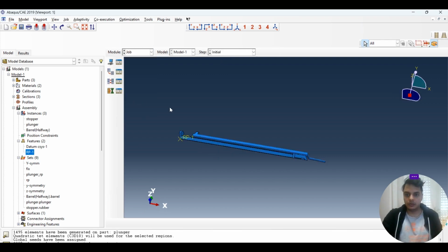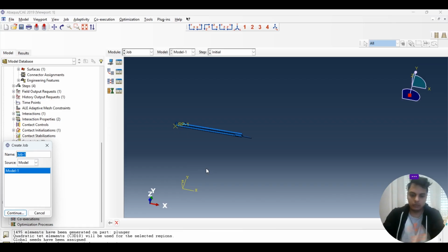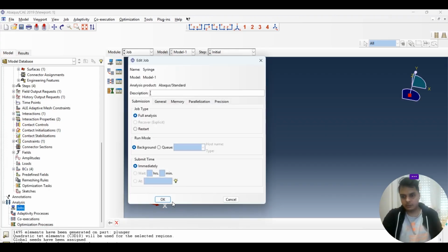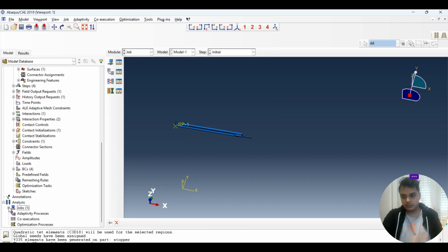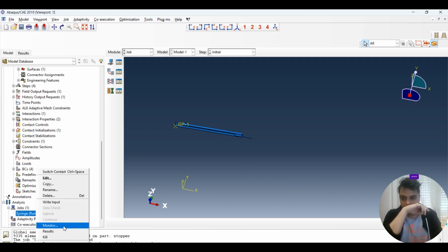We have to just submit our job, and I will just create it and say plunger pull, or we can simply say syringe. So continue. So fine as of now. So probably it's going to take a bit of time, and we can check it out somehow. We can also monitor it.